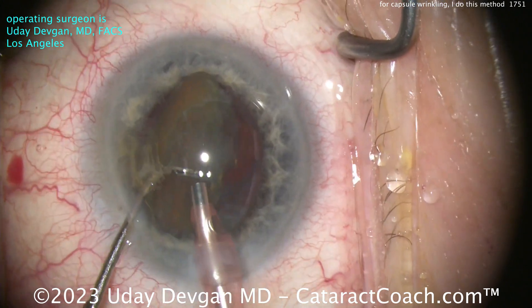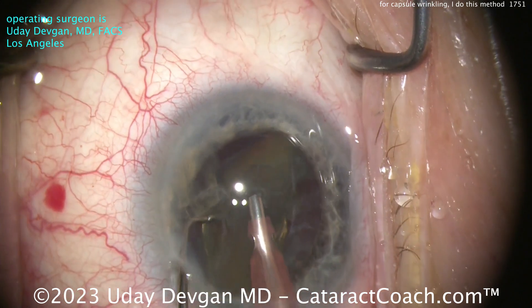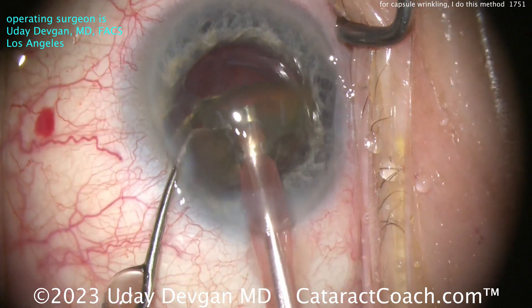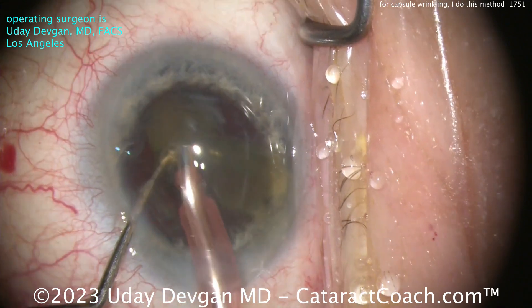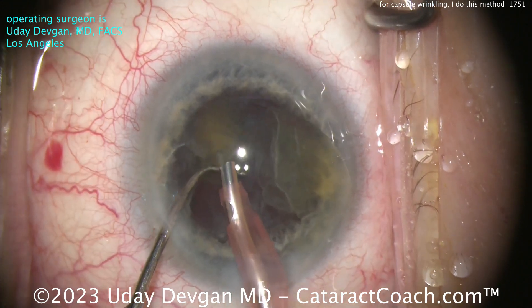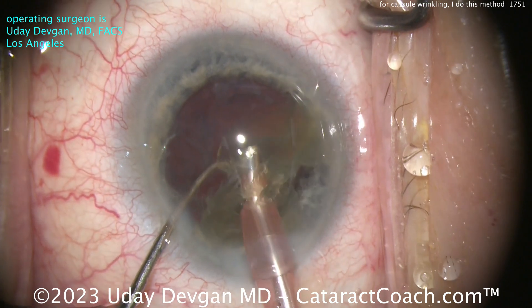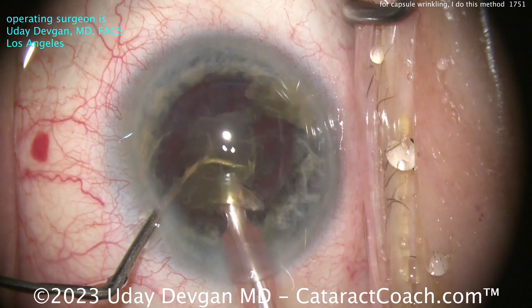I want to show you a real life case — this is a tough case, not a simple case. Some aspiration here, more debulking of the nucleus. We're essentially doing a tilt-and-tumble technique, still trying to get a chop going. In a case like this, after we move the cataract, you're going to have little bits of nuclear material that have gone through gaps in the zonular support and will be sitting in the anterior hyaloid face. Not a single chop achieved — basically a tilt-and-tumble technique getting these pieces out.